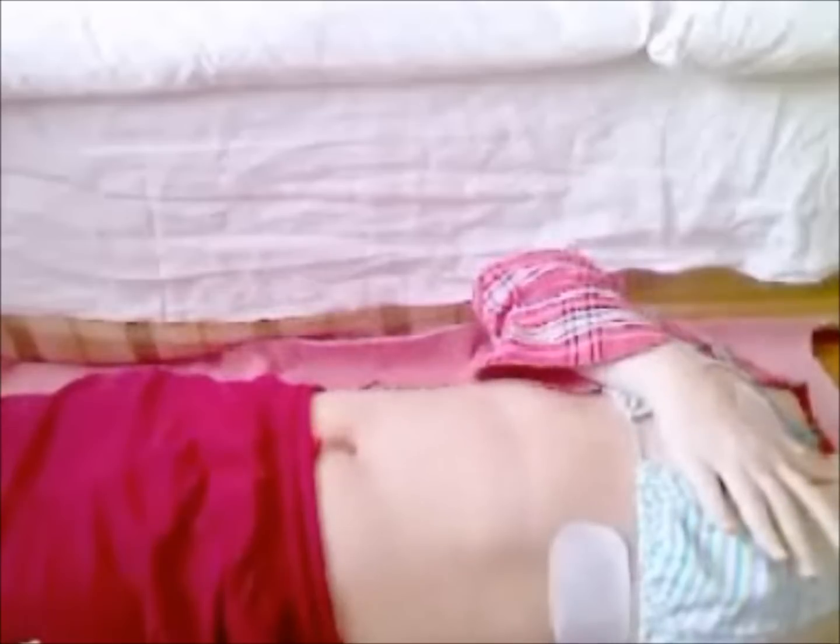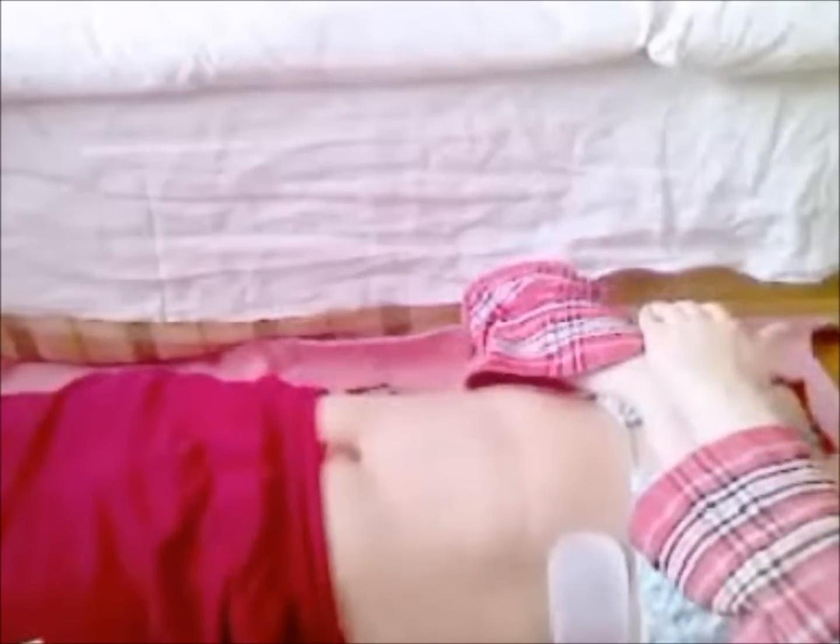Begin CPR. For help with CPR, press the flashing blue button. Place one hand in the center of the chest between the nipples. Place your other hand on top of the first. Push the chest down firmly two inches. Keep time with the beat. Pinch nose, tilt head, and give two full breaths.